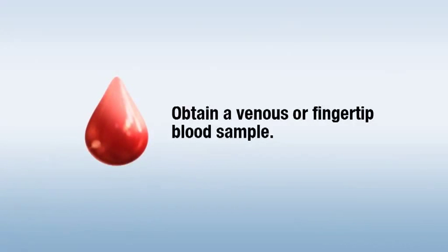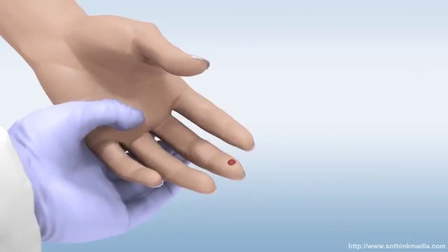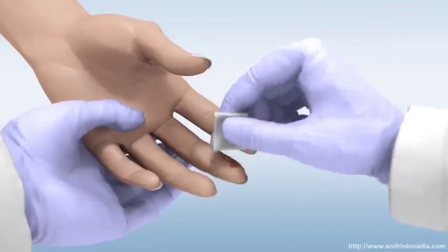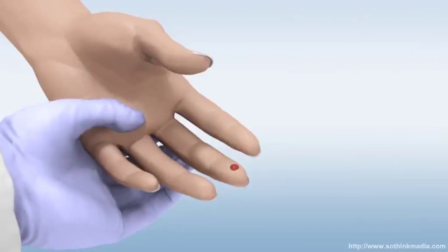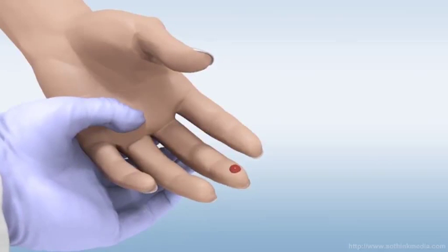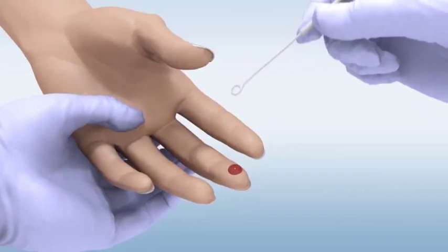Obtain a venous or fingertip blood sample according to your normal laboratory practices. If you're taking a sample from a fingertip, wipe away the first drop of blood after pricking the finger and sample from the second drop.